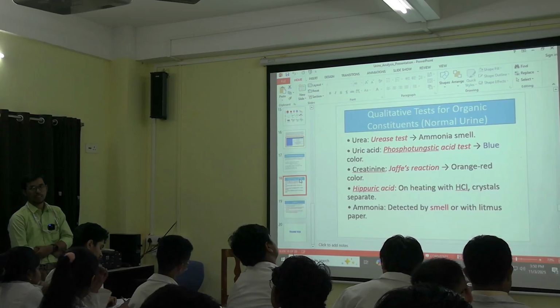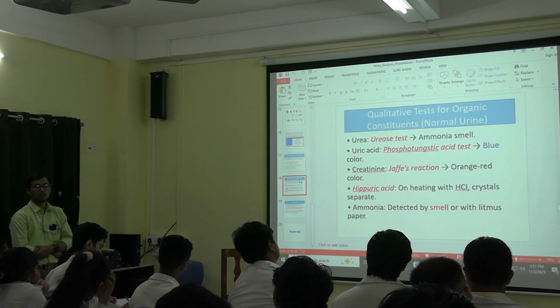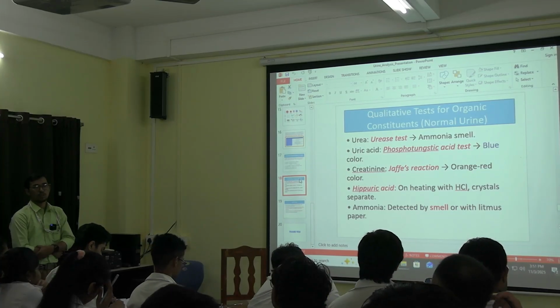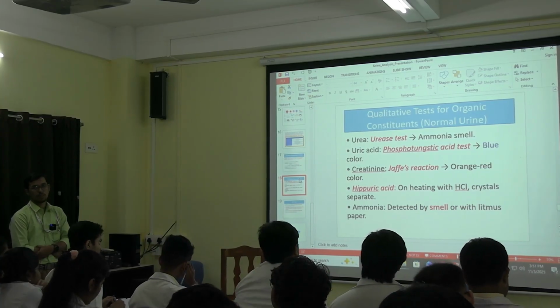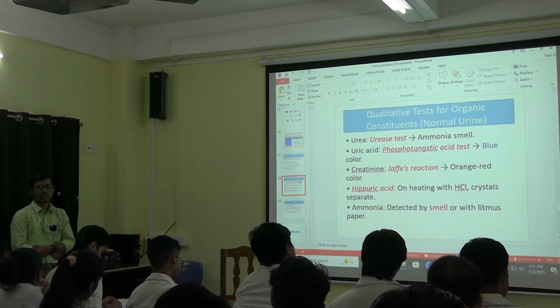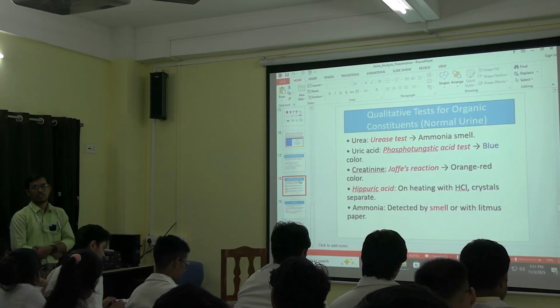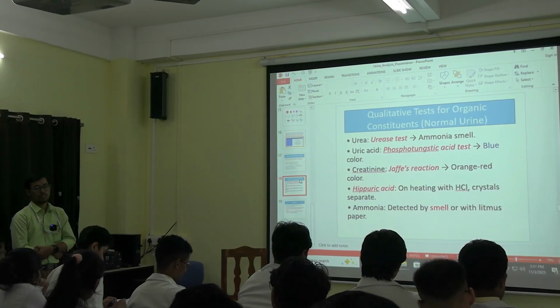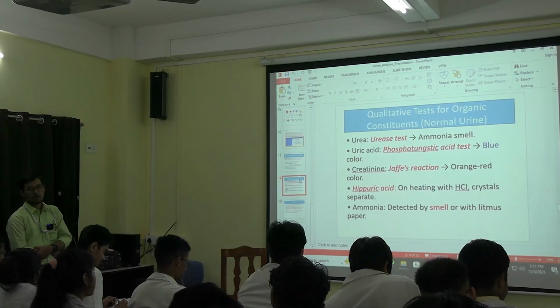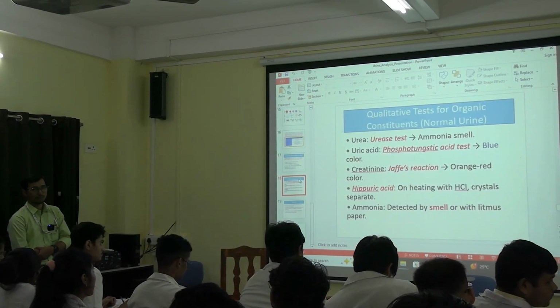And then you may be taking certain drugs, like, you have heard of TB. In TB we give rifampicin, which gives orange to red colored urine. So if a patient is on anti-TB treatment, then you have to give the history to the biochemistry technician, or whoever is doing the test, that it is a TB patient undergoing ATT, anti-tubercular therapy.